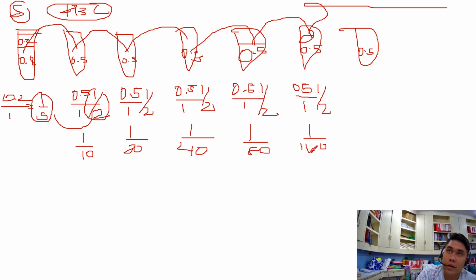You need to collect serum and your whole blood for the cold agglutinin test from the same patient; the sources of serum and RBC for the cold agglutinin test cannot be different. So you have your 3% RBC suspension, add 0.5 to the first test tube.